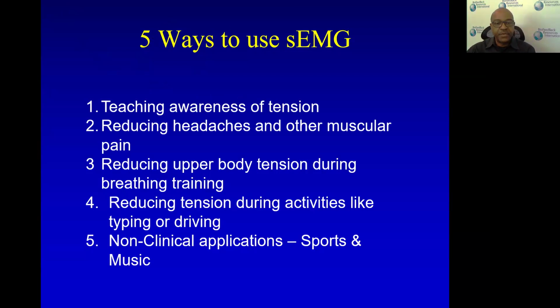Reducing tension during activities like typing or driving. So often people are not aware that they are tensing muscles when they're doing other activities. And by tensing those muscles unnecessarily and for long periods of time, it can produce symptoms like pain. Also, exhaustion. You're burning extra energy you don't need to.